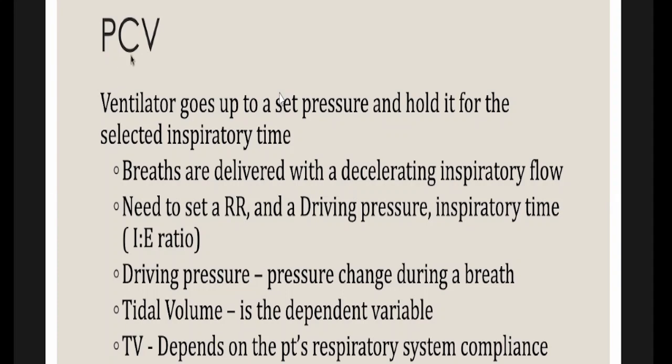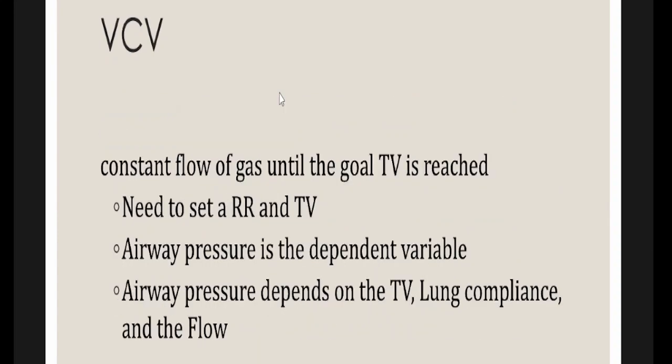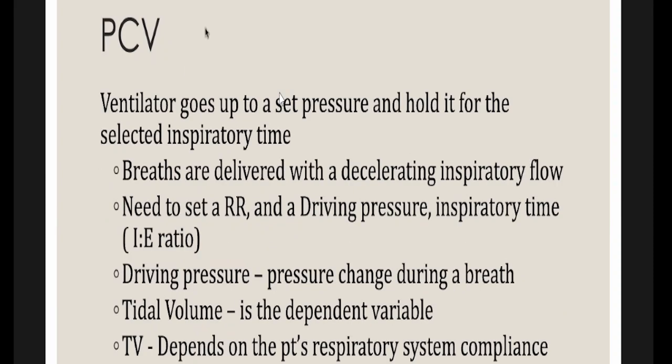The simple idea is you can't expect one number in tidal volume when you go on pressure control ventilation. But on the other hand, when you go on volume control ventilation, you will always see only one number in the tidal volume, whereas in pressure control you will not see one number, but instead it will change with each breath.